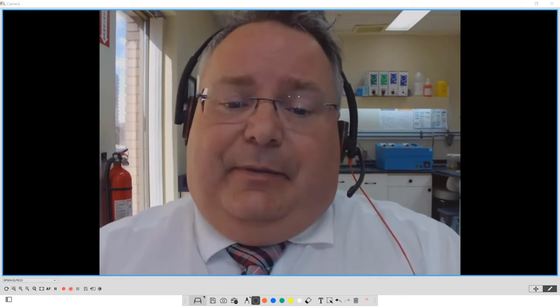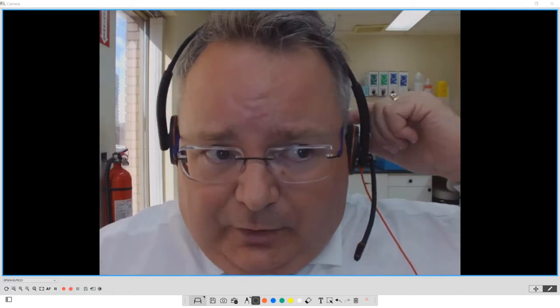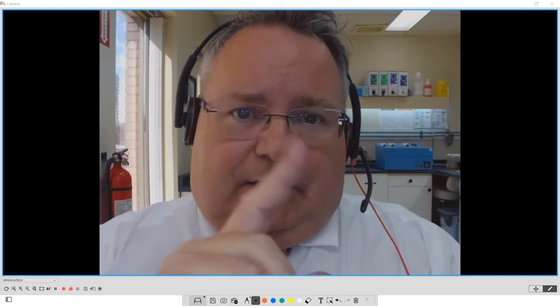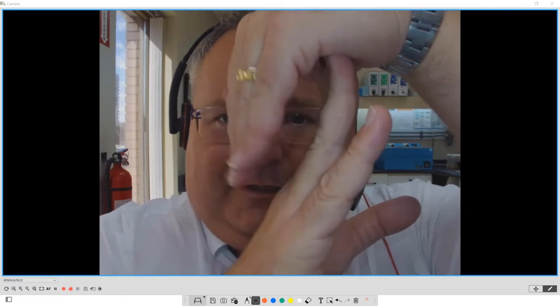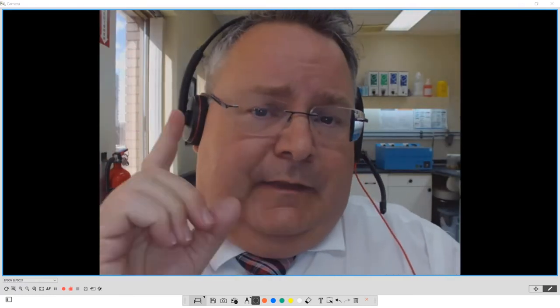I've had patients come in and I bring in cucumber or green pepper. I find that a red pepper works well. And I'm looking to watch the chew cycle of that person. Challenge yourself. I've set teeth and I've showed you with 5 millimeters of overjet, overbite, pardon me. And the case works. Why?